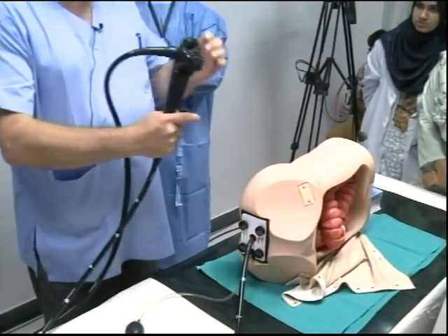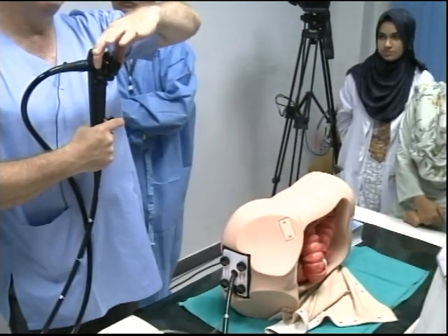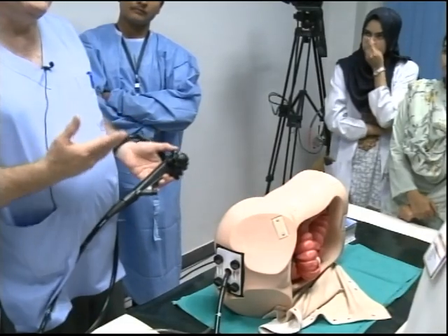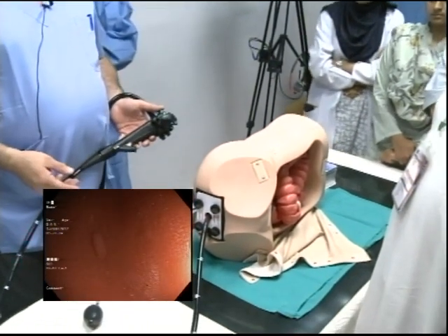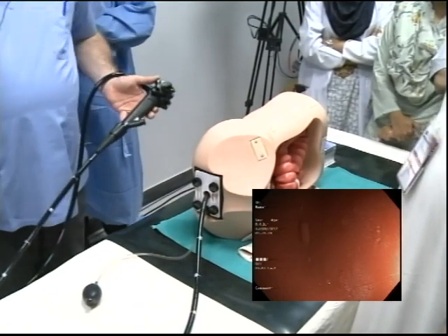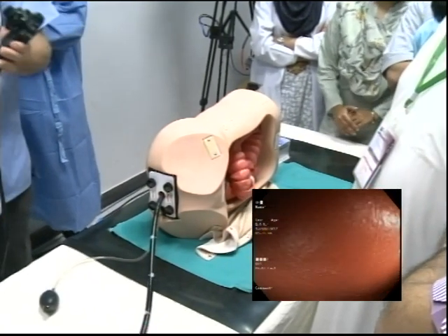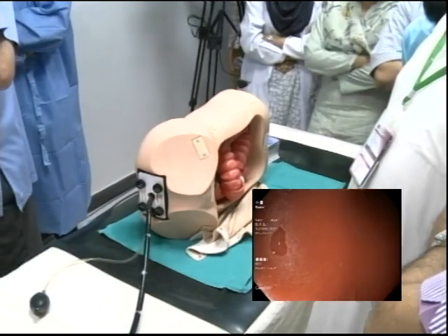Scopes. The buttons, you've got letters on them. Keep them neutralized. 10 to 2 position all the time. Thumb. Anything that you do with a scope, it's slowly. So when we want you to do something, it's slowly. Not too slow that I grow a beard, but slowly, okay? I want to rotate the scope. I want it to look right. See the scope? I am not doing anything with the wheels. I want it to look up. See the scope?